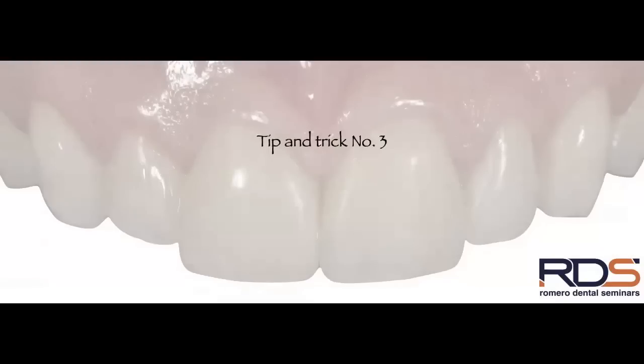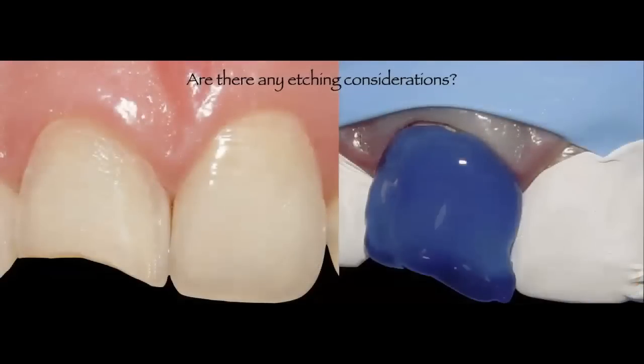Now, on our tip and trick number 3, there's one thing that you have to answer based on that previous consideration. Are there any etching considerations that I need to take? And there will be different etching patterns or different etching times based on preparation or no preparation. When there is preparation, when there's been a burr in contact with the enamel, we all know that that rough surface created by the burr requires less etching time. So like in the case that you're seeing right here, if I have prepped enamel, I just need to etch for 15 seconds. If I have unprepped enamel, like the case that I showed you before, I would recommend that you double the time of etching.